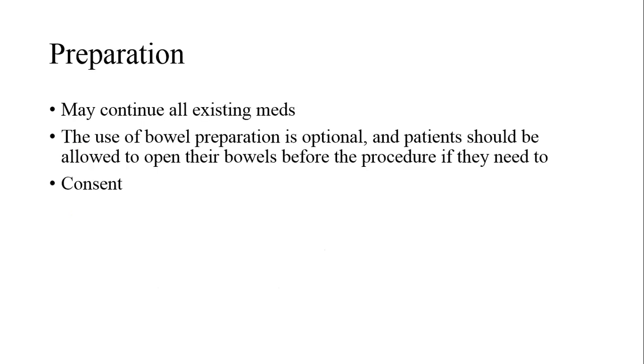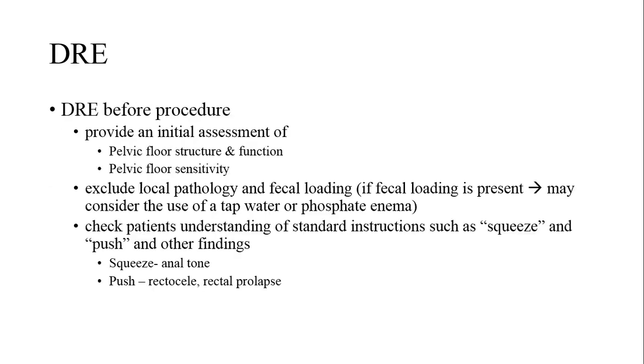Among the preparations required, patients can continue on their routine medicines, no reason to stop them. The role of bowel prep is rather optional. It's best for the patient to open their bowels just before the procedure. If they have impacted stools before the procedure, then we can consider giving an enema to empty their bowels, and they will require a consent also.